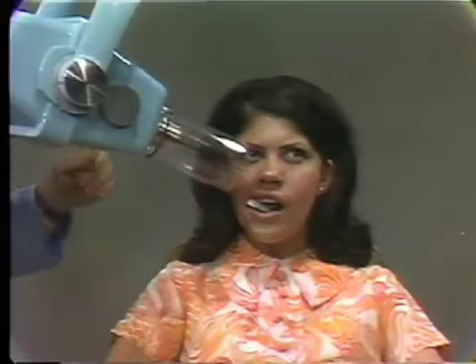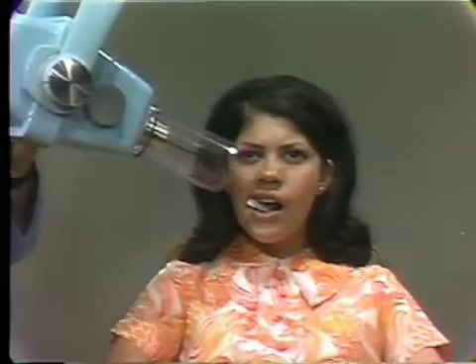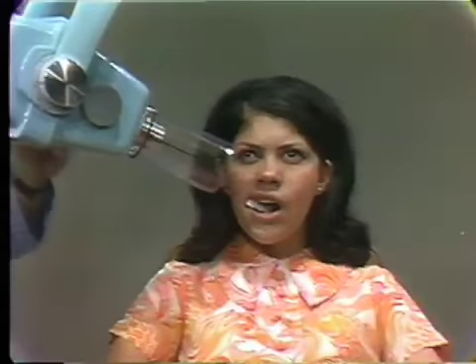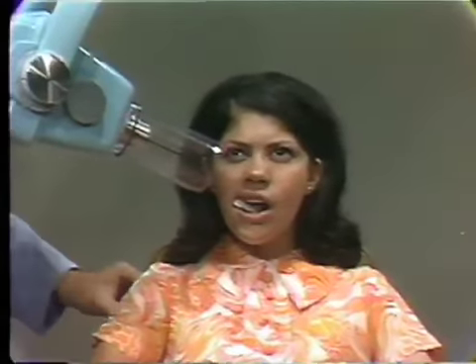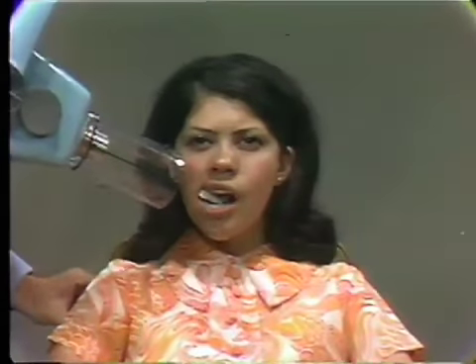Right now, the central ray is aimed too high on the young lady's head. Also, I have to keep the machine away from her just a tiny bit. I want to raise her until the path of the central ray is aimed at the gum line of the teeth. All right, I think we have it about there.